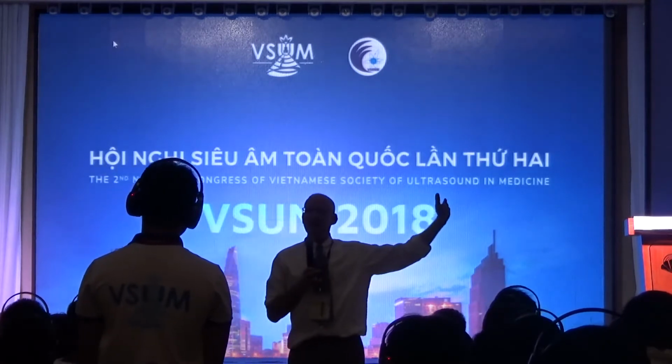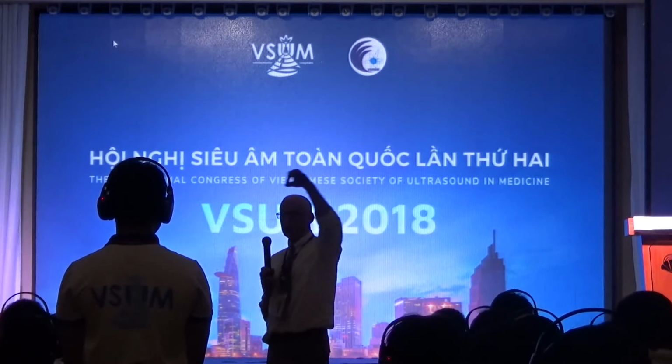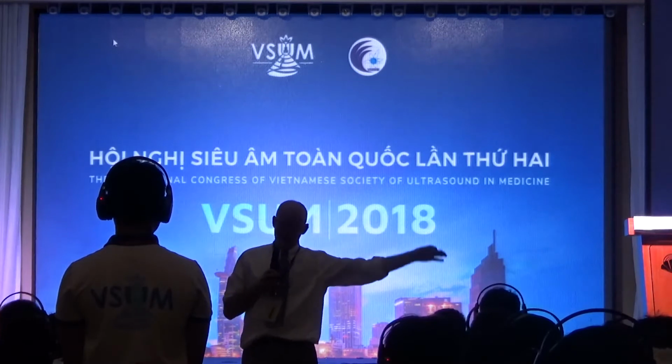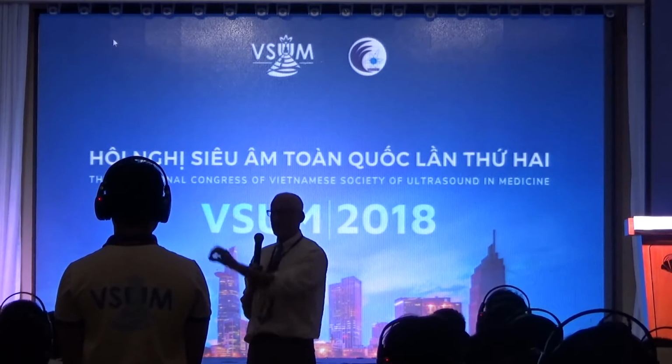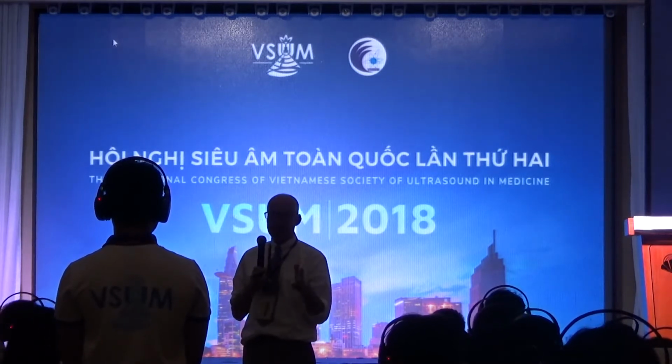That means the values from 25 to 75 from the median: 25 below, 25 up, divided through the median. It's given by the machine, the interquartile range.